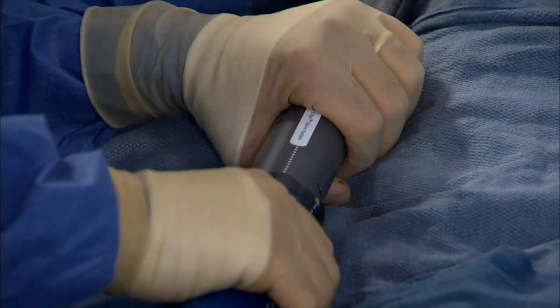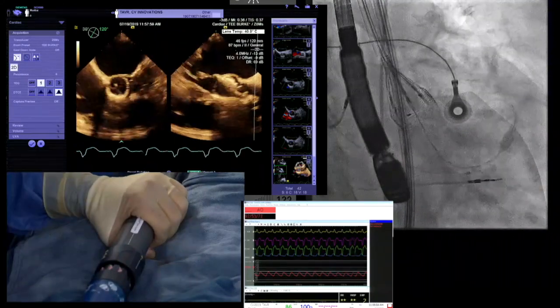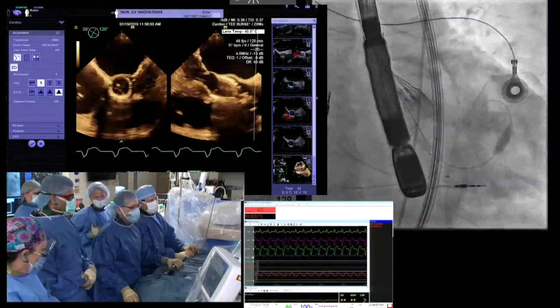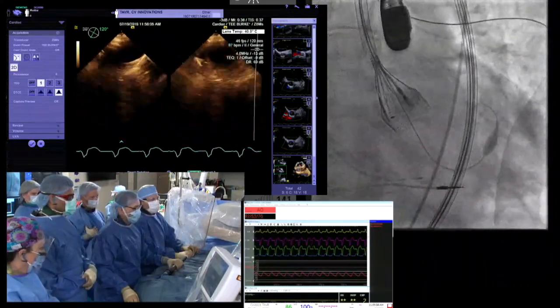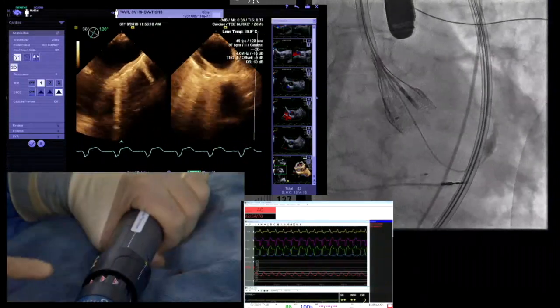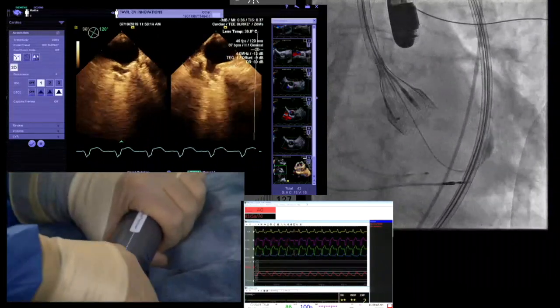I don't know if you're going to be able to see it. Let's get off of it right now. Yeah, why don't you go that way a little bit? Go back to our implant angle and see if they can see the release pin. Bob, I'm going to need you back. Yep. There, now you can see the release pin. That's great. So as I match up these dots to the dots here, it's so easy if you just color within the lines.